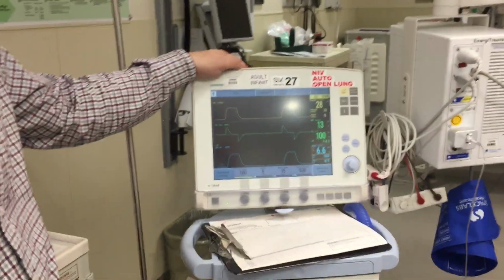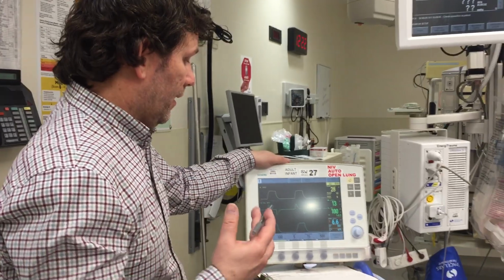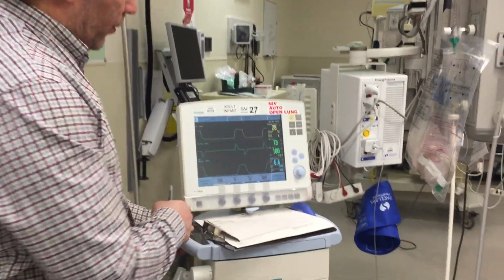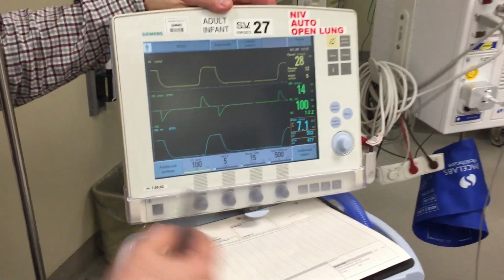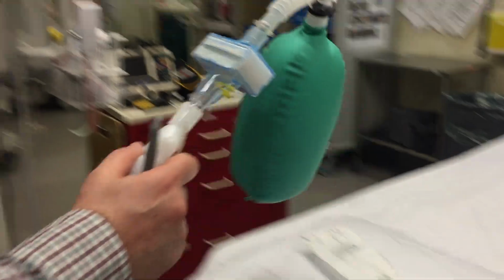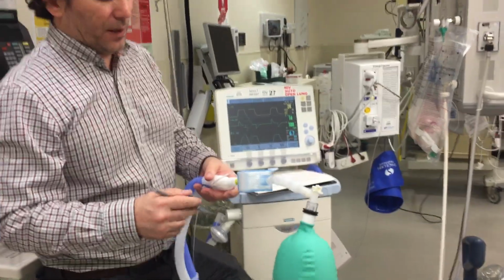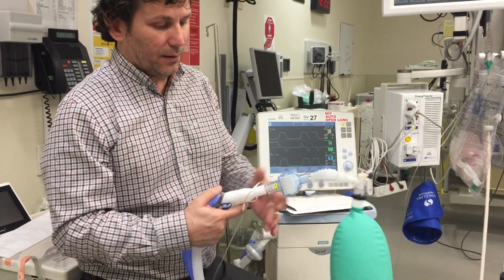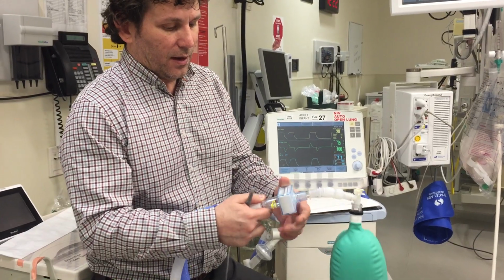And that pretty much is how you would ventilate somebody in a pinch. Again, that button is to activate and deactivate it. If you want to go on transport, say we're done, there's a couple steps you need to follow. The first thing we recommend is that the patient still be ventilated. When you disconnect the circuit, the patient will be bagged. They need to have this filter in line. No matter what, we always have it in line. Specifically with COVID, it's critical.